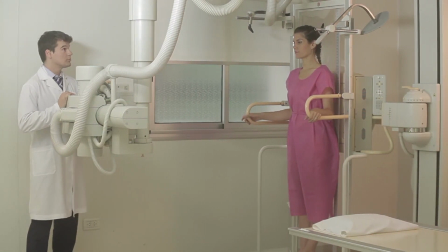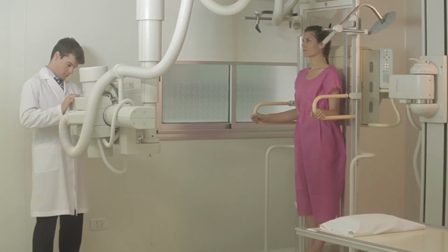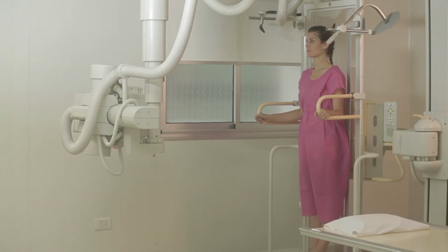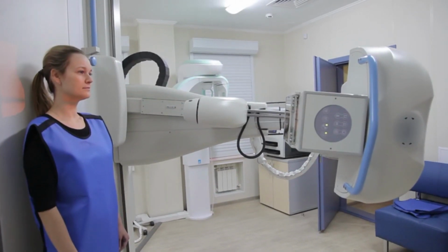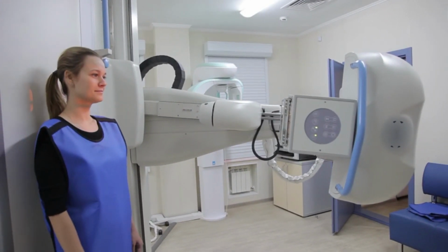Once the patient is positioned, a typical X-ray requires only a few seconds to take. They are fast and inexpensive and excellent for evaluating bones and common problems, such as a cough. Some are portable, so can be wheeled around a hospital as needed. As the name suggests, an X-ray machine emits a wavelength of electromagnetic radiation called X-rays. Their downsides are that they are limited in their ability to see soft tissue organs, and they emit radiation which can be harmful in large amounts.